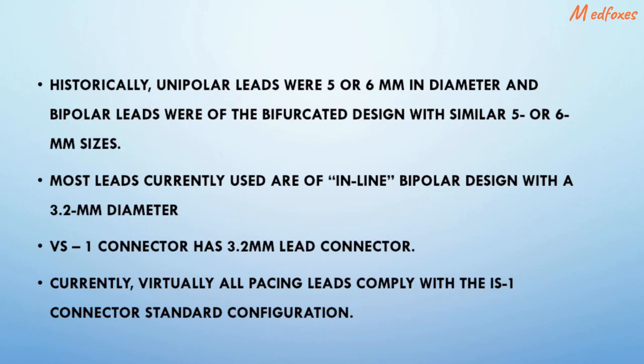This voluntary standard incorporates sealing rings on a 3.2 millimeter lead connector and is referred to as the VS1 standard. Subsequently, an industry-wide international standard configuration known as IS1, or International Standard 1, was developed and accepted. Currently, virtually all pacing leads comply with the IS1 standard connector configuration.